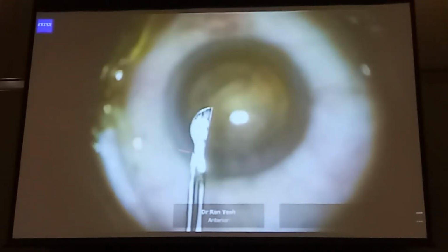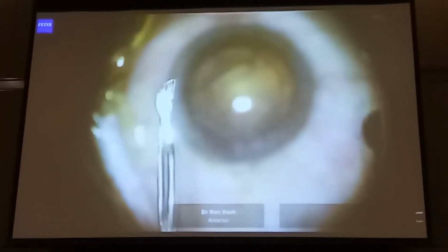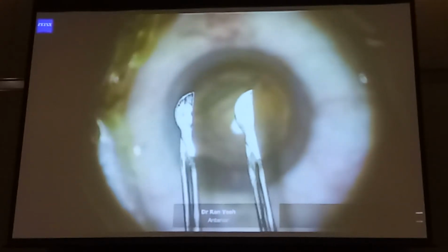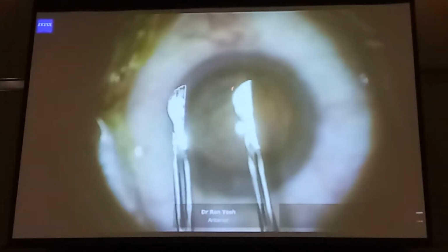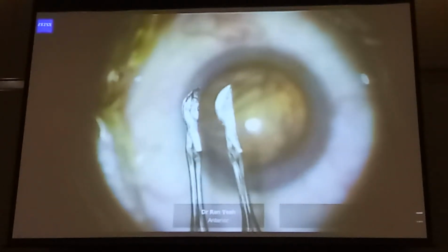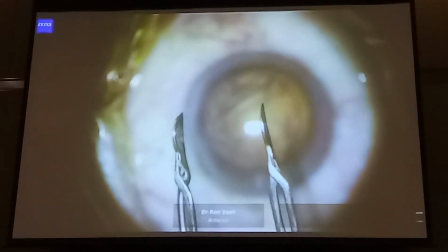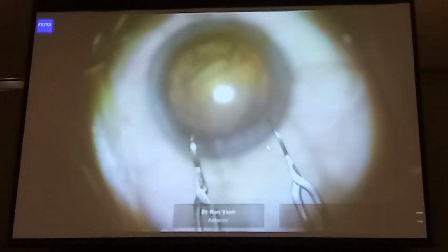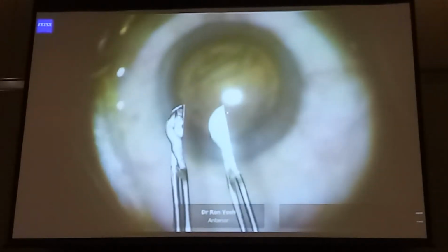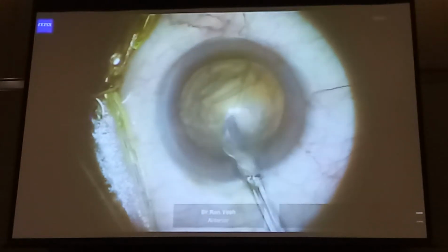Here's the original combo 2 pre-chopper, which is still a very good instrument, but only up to 1.5 or 2+ at most. Here's the newer combo 4, and when I turn it on its side, you will see that there's a bevel here, and it's made much thinner and sharper to enable it to penetrate the denser nuclei more efficiently. Here you see the difference. Here is the combo 4, here is the combo 2. Much slimmer and more tapered at the tip. It's really very, very effective. There you go, how sharp that is compared to the old one.